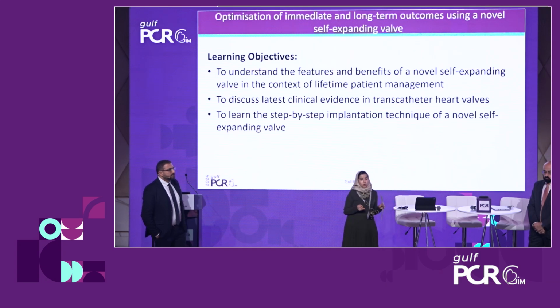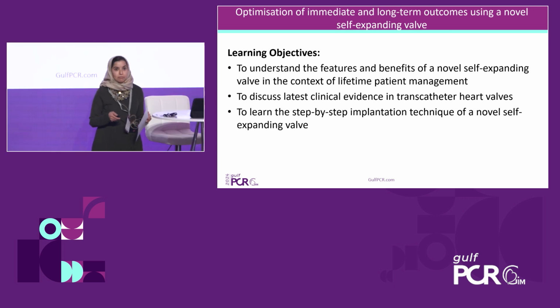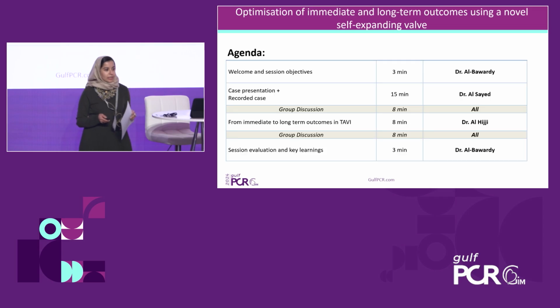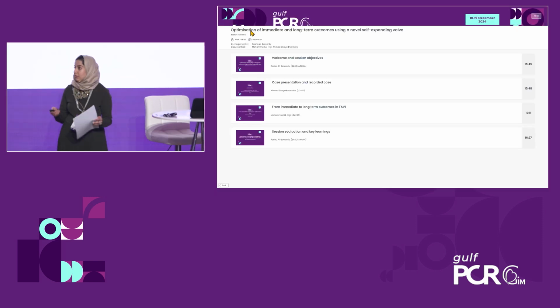So the plan is to go over the platform of ACURATE Neo2, mostly in the context of lifetime management. We're going to discuss the latest clinical data, and then we're also going to talk about step-by-step implantation technique. So without further ado, we can go ahead and get started with your case.